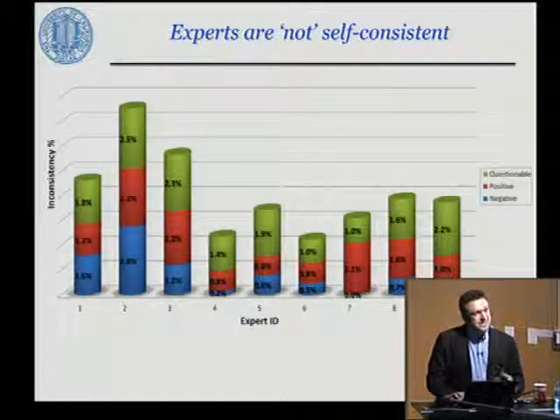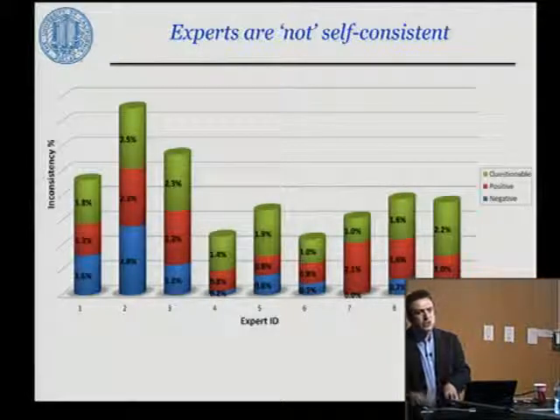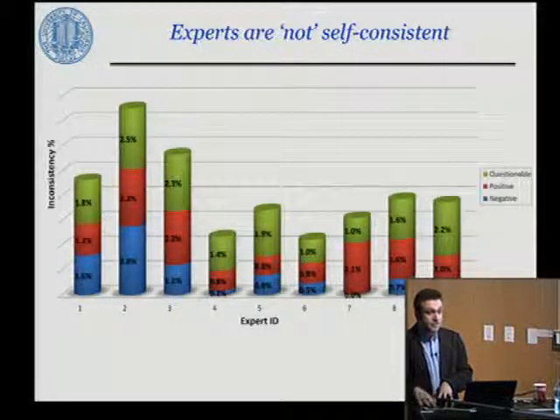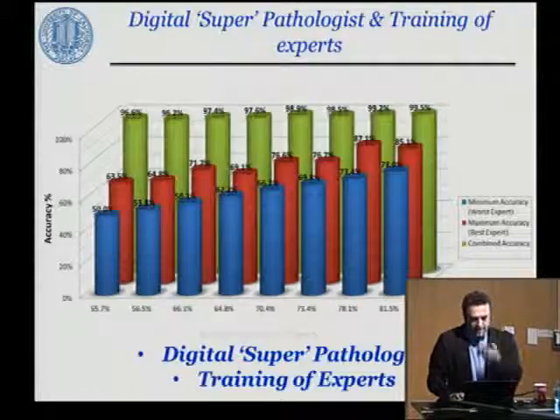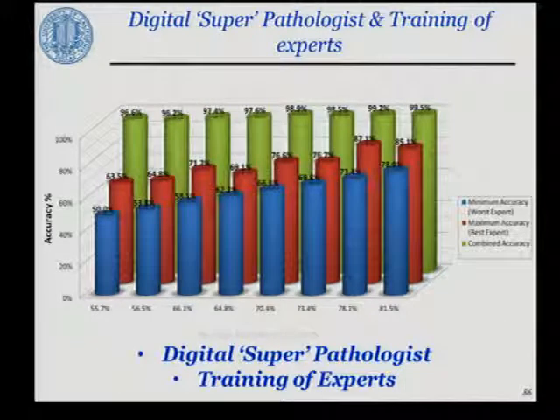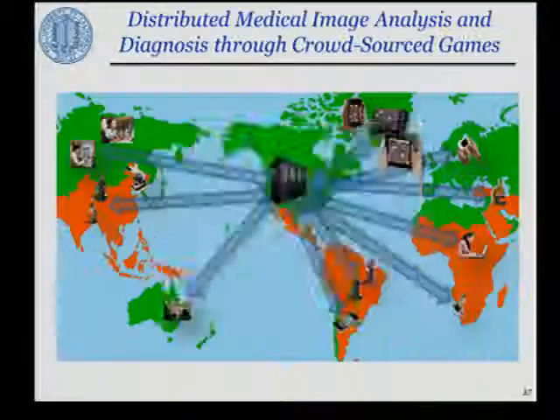So this gave us a nice statistical framework to create actually a global library of cell images that are very well characterized by the consensus of the experts. And actually, our goal was two phases, 2 different directions. One, to digitally create diagnosticians by combining a group that is not competitive individually, but when they get together, they become super pathologists digitally. And the second, to create training tools for evaluation of diagnostician quality. This phase is now recently implemented.